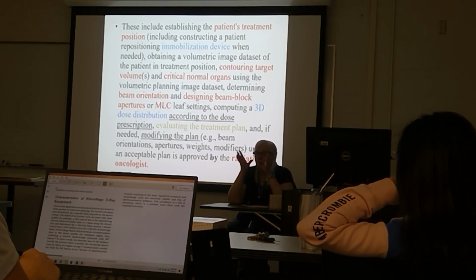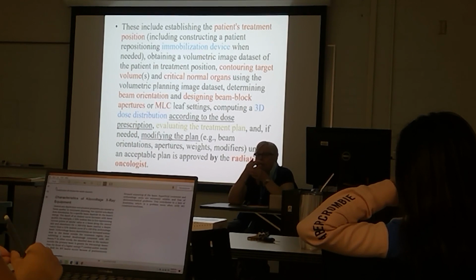If you could get away with it, water is wonderful, but it gets messy, as you can probably figure out. But superflab is very close. So is paraffin gauze, or beeswax, or believe it or not, dental wax. You know, the pink stuff.